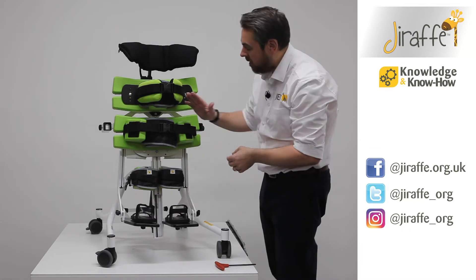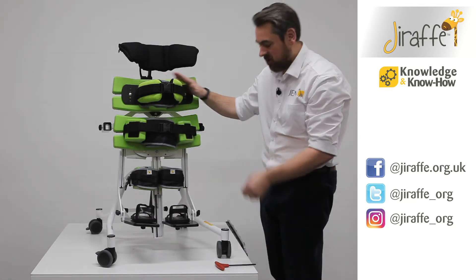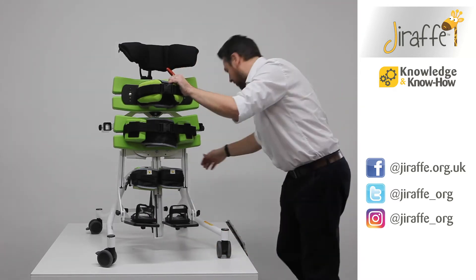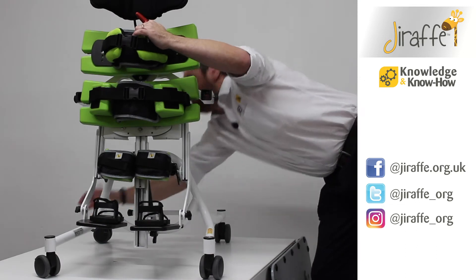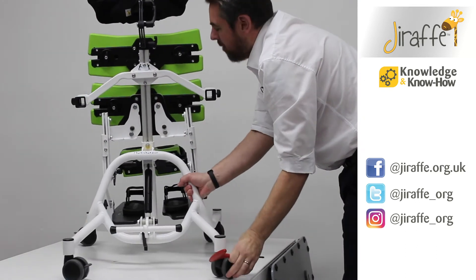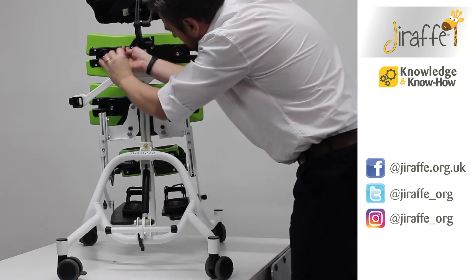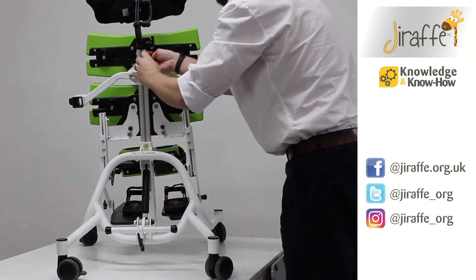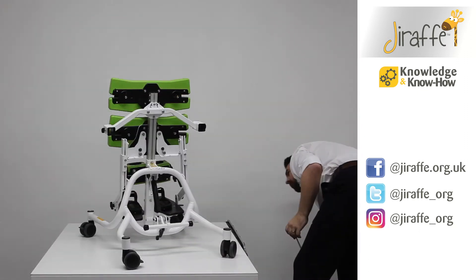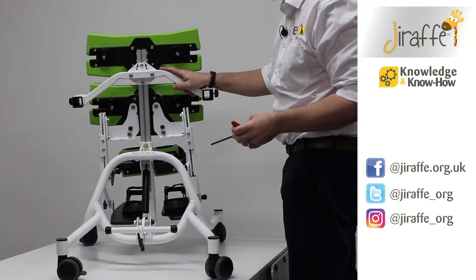Pelvic support stays exactly the same, as does the trunk support. The other thing we're going to want to do is rotate the product around, pop our brakes on, remove the head support, and place that to one side.